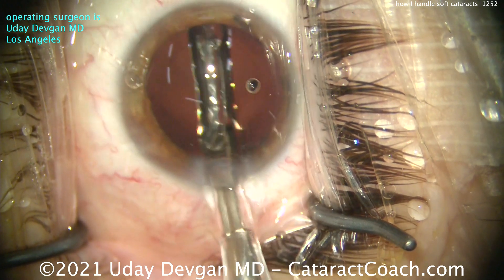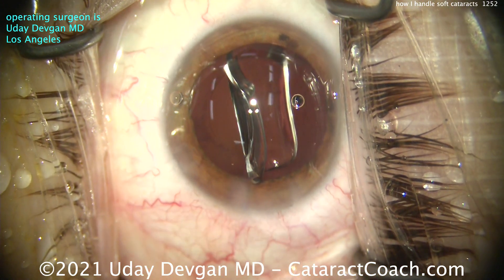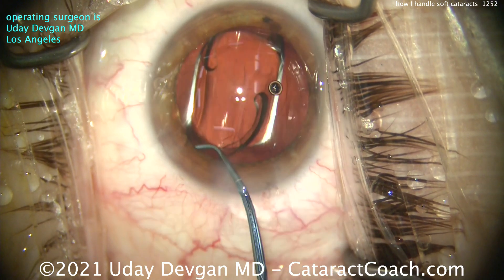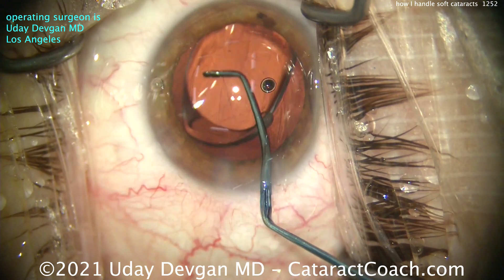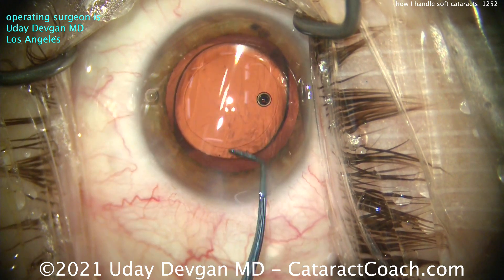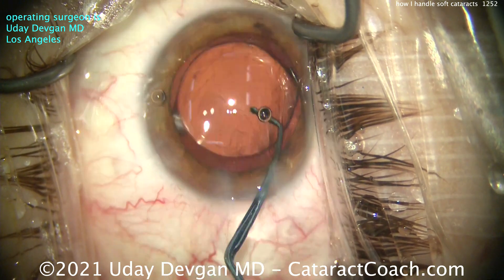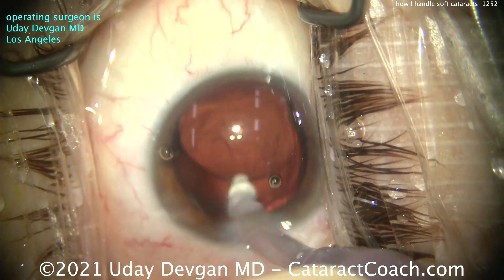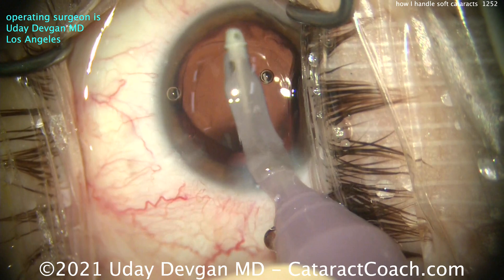Here comes the lens going nicely into the capsule bag — placing it in very gently and letting it open up. Single piece acrylic lens. Is it a monofocal or an EDOF? Look at that capsular polishing with the chopper tip. I am a perfectionist — I like to polish that up a little bit. It looks like a monofocal lens. We'll get that rotated around and put it in the position that we want. Look at the overlap of the optic by that rhexis — I like it, it's a good overlap. Let's go inside here, remove viscoelastic, and get this lens centered on the patient's visual axis.